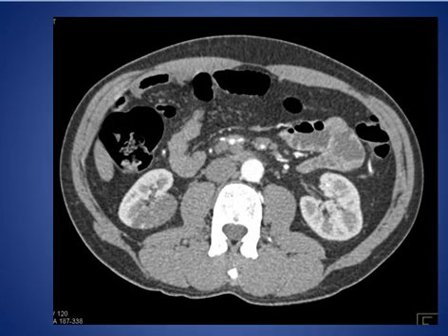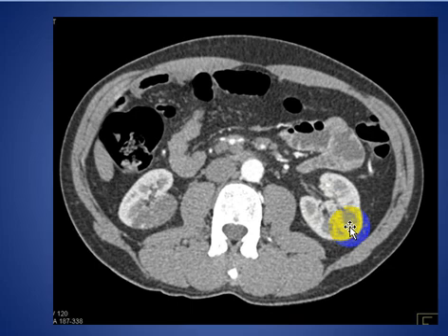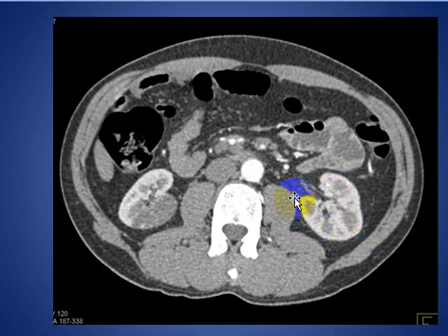I will present a case of the kidney. As we see here, it is a selected axial CT scan image of the mid-lower pole of the kidney. This is the corticomedullary phase. On the left side it looks normal — the cortex is hyperdense compared to the medulla.